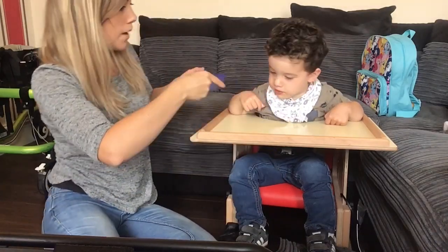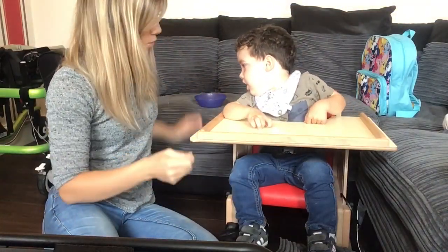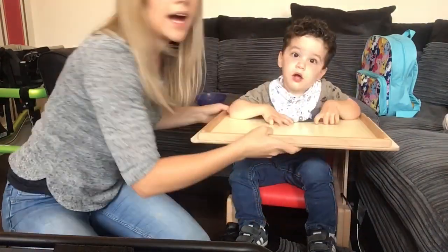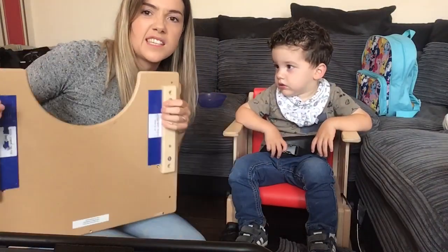The table — I'll just show you quickly. Take Wilson's grapes away just for a second. There we go. So the table is just a little twist and it slides off like that, just like a little twisty thing as you can see.